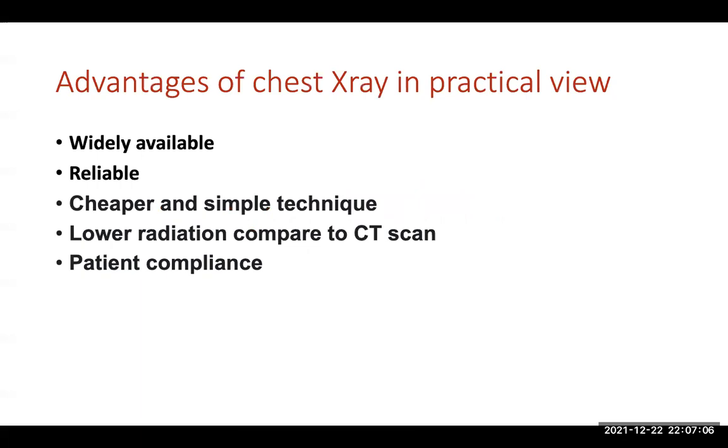So the first thing is, what are the advantages of chest X-ray from a practical view? Number one, chest X-ray is widely available. Nowadays chest X-ray is available even at the upazilla level, and sometimes we see that digital X-ray is also available. So it is widely available and also reliable.